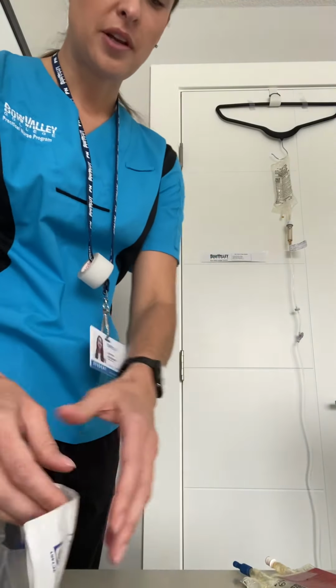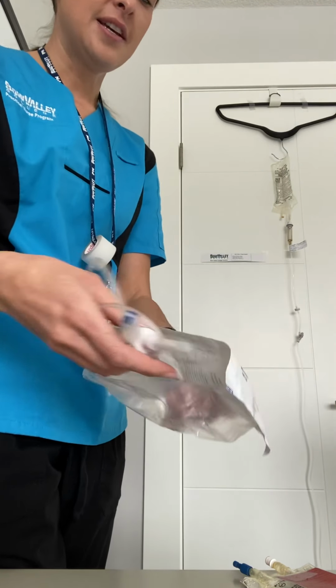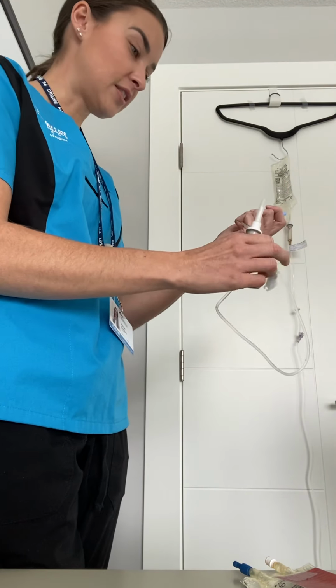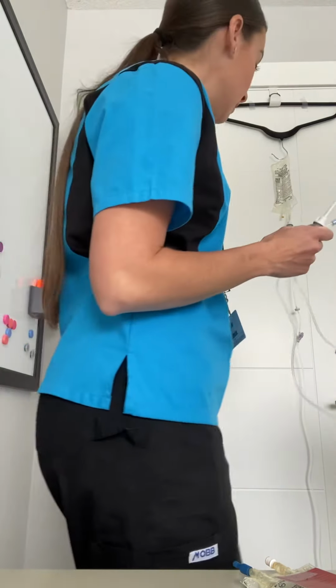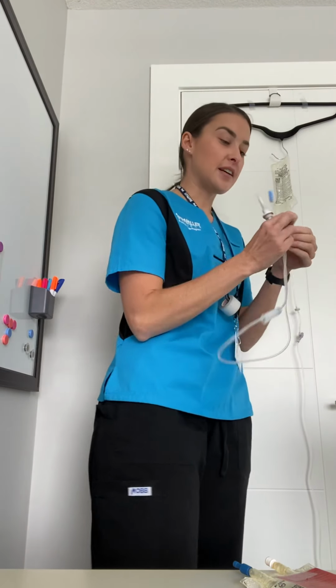And now I can open my second line. Just put this to the side here. And what we want to do is make sure it's not tangled first. Coming out of the package, perfect. And we have swabs here, and I just want to swab the port for 30 seconds.